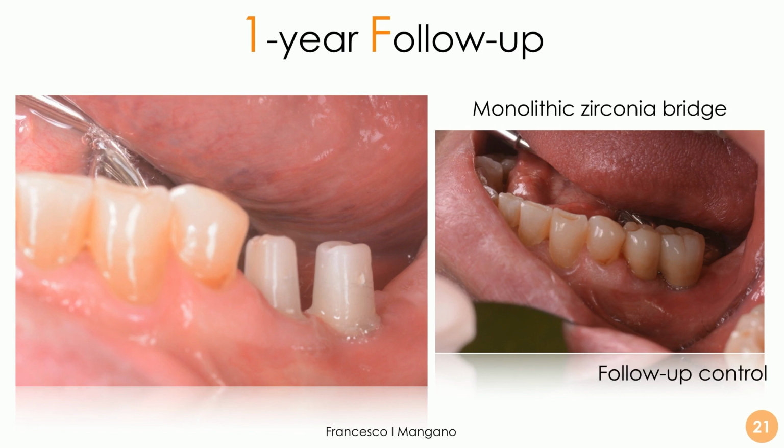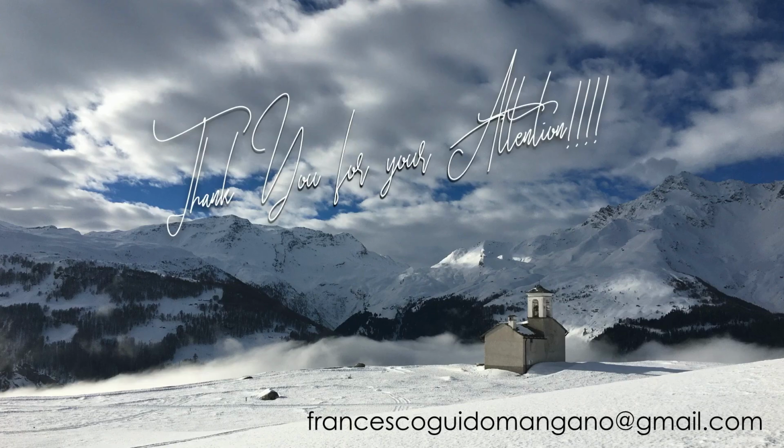There's a perfect sealing of the soft tissues around the abutment that is placed there and no longer removed, and then there is the restoration that is a final monolithic zirconia bridge, perfectly integrated from the functional, aesthetic and biological point of view. This is an example of full digital workflow in daily dental practice.